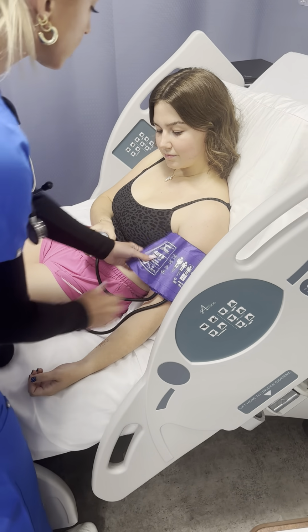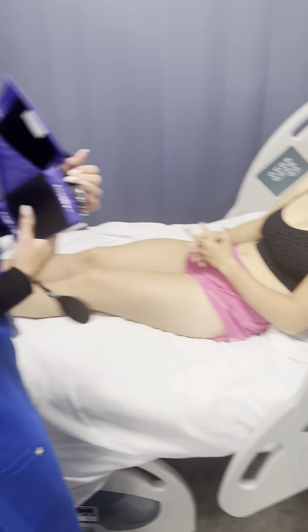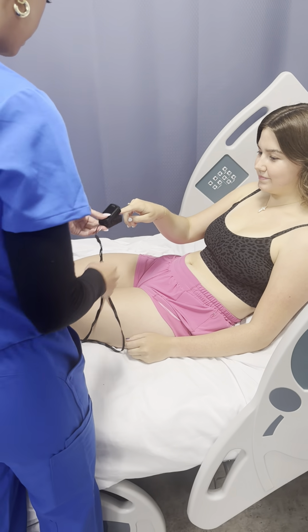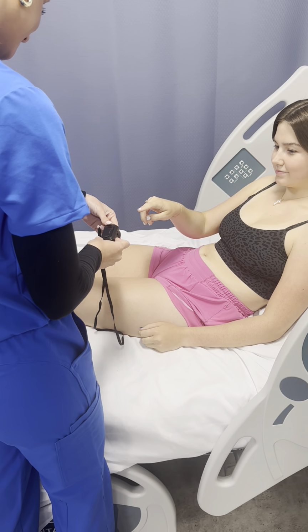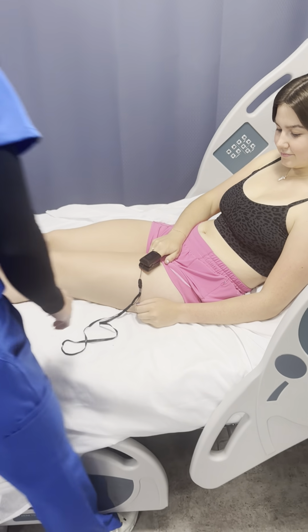Perfect. And your systolic was at 100. So when we do your regular blood pressure, I'm just going to add 30 to that for your systolic. Perfect. Now I'm just going to take your pulse oximetry. Just make sure it's on first. Perfect. You can just rest that down there.